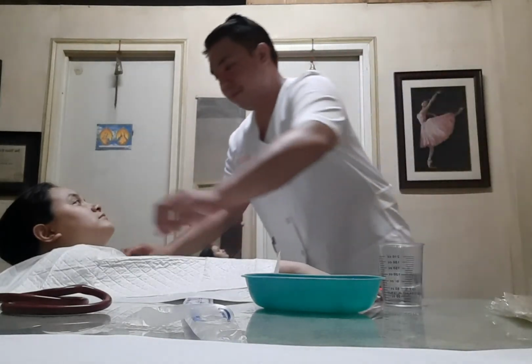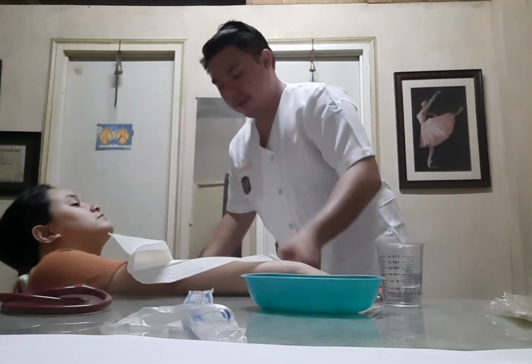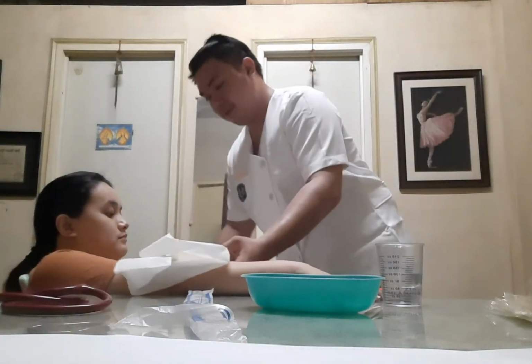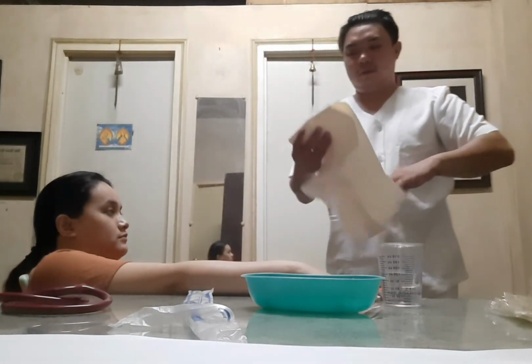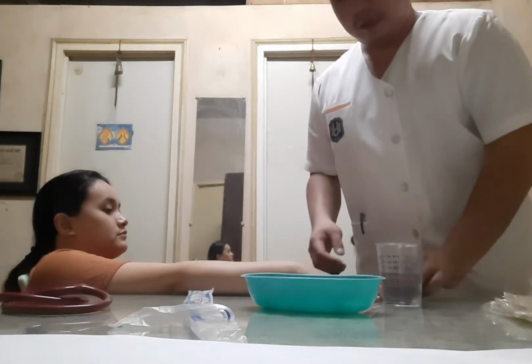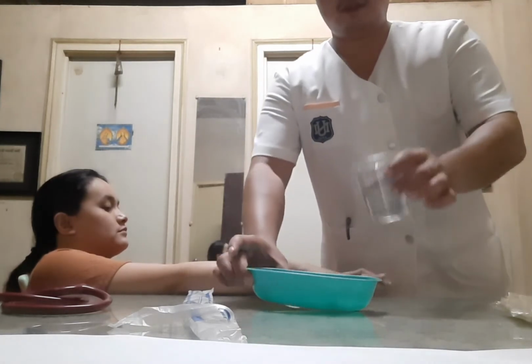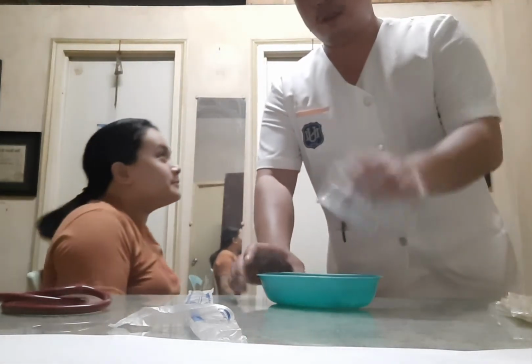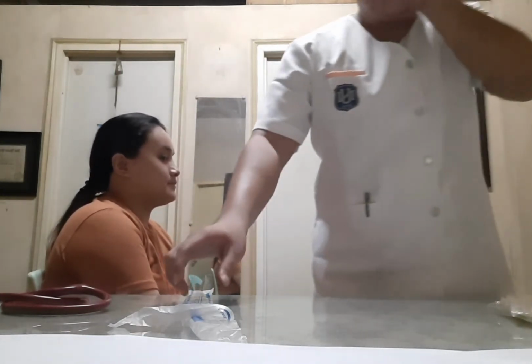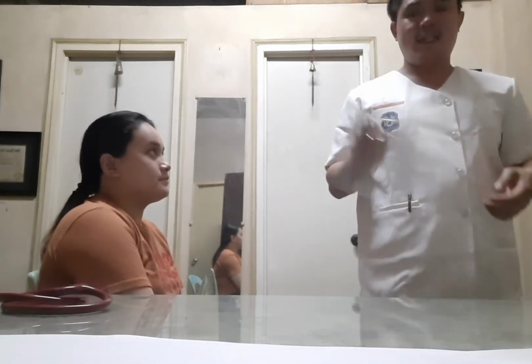Discard, and then dispose of this water, and dispose of everything here.